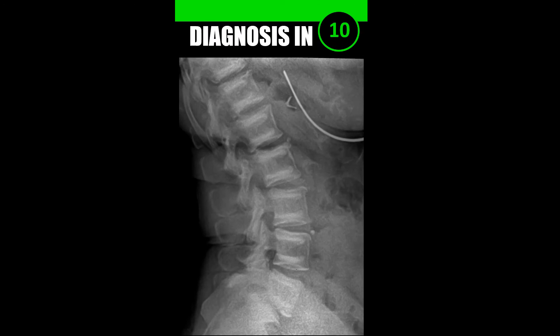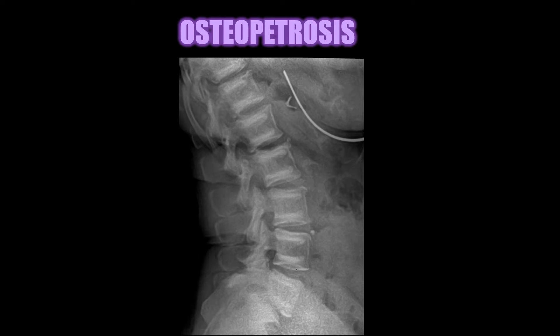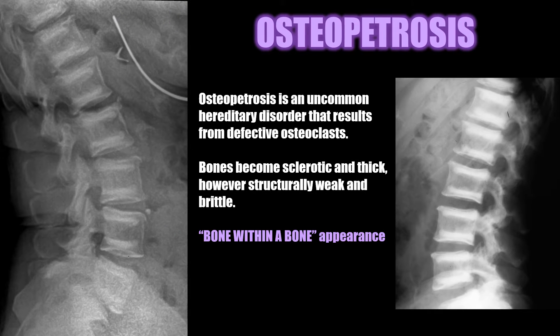Case number three: this is a classic example of the bone within a bone appearance seen with osteopetrosis. Osteopetrosis is an uncommon hereditary disorder that results from defective osteoclasts. Bones can become sclerotic and thick, however they're structurally weak and brittle, and radiographically they present with this bone within a bone appearance.